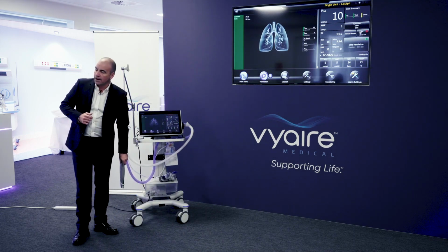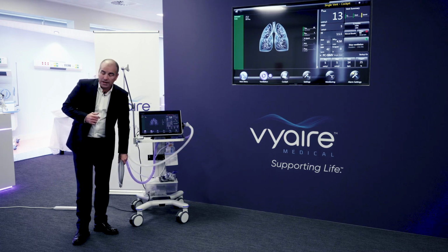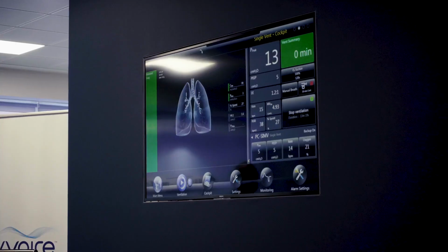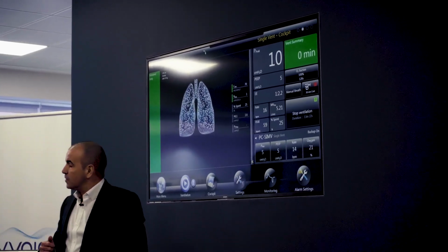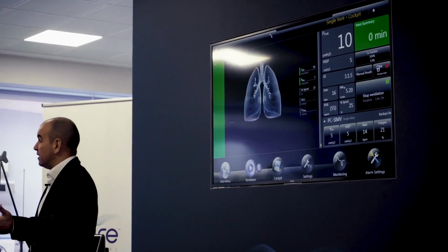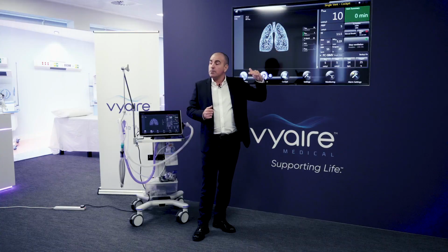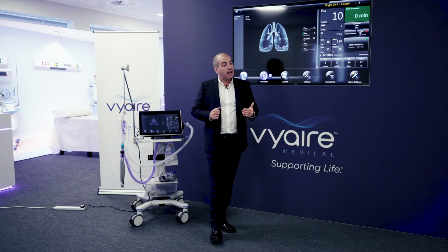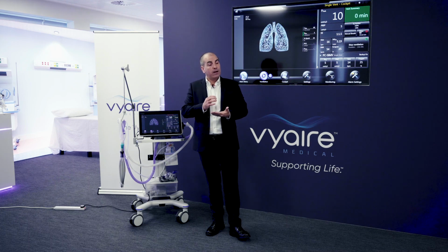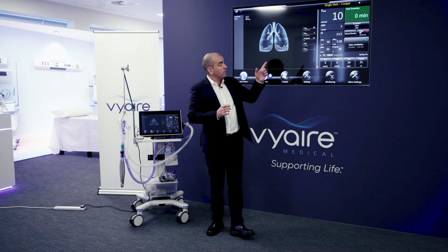in the scenario whereby they've turned the sedation off the patient and the patient starts to wake up and they start to take spontaneous breaths, you see there the purple diaphragm. There we go. So a timer will start so that when the doctor comes onto the department, maybe half an hour, 45 minutes, an hour and a half later, or after they finish their case, for instance, they can come on and this timer will start counting up. And then they have something concrete to work with: okay, this patient has met my objective metrics for X number of minutes.